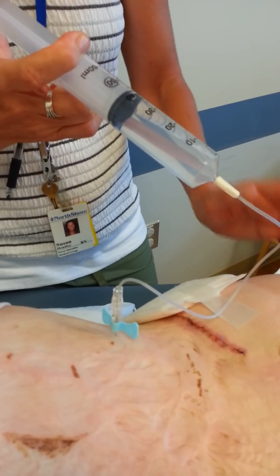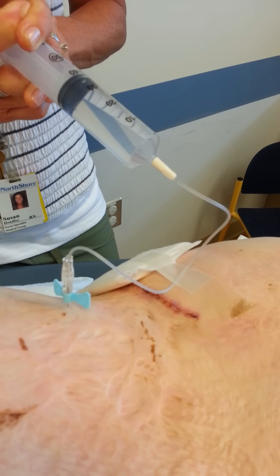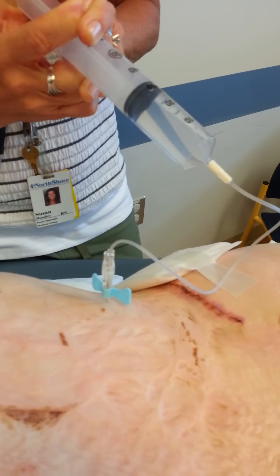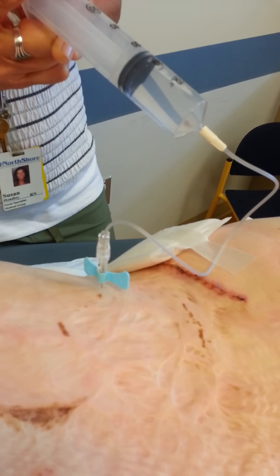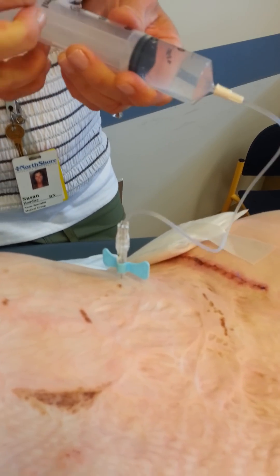Do you feel anything, Stacy? No? Good. Did you feel the needle going? Mm-hmm. Yeah, not too bad? No, it wasn't too bad. Good. When you're really going to probably feel this more is when you stand up, because the weight of these things will just drop down.